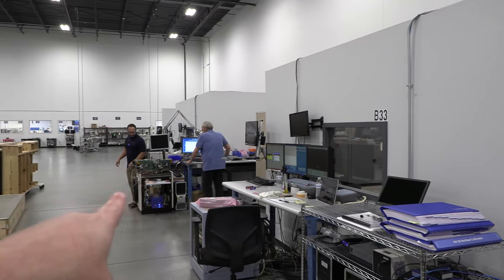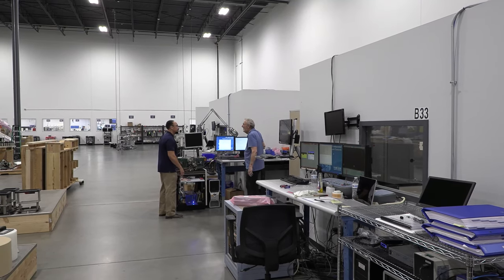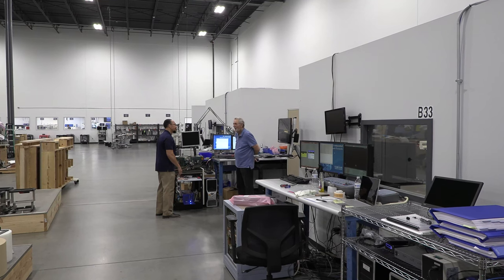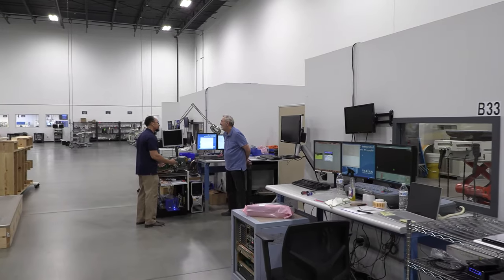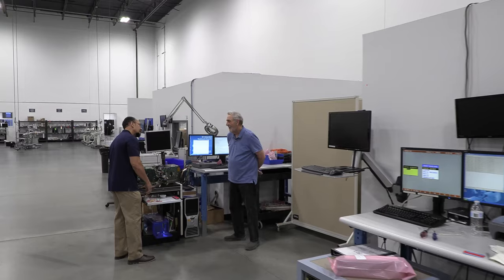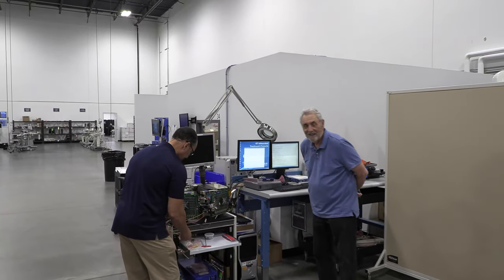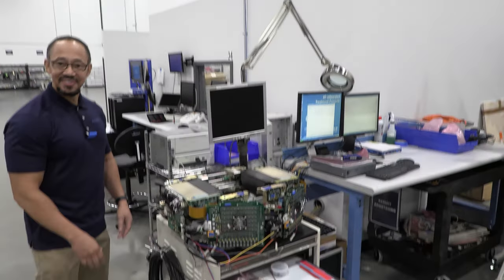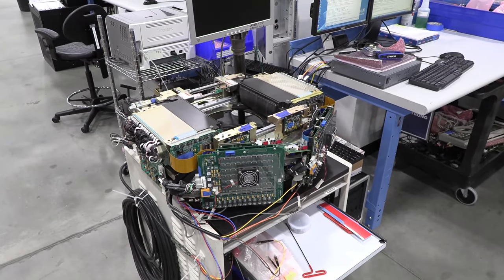That over there looks like a test bench too. That is our MLC test. Instead of doing it on the head, once again, since we have so many parts of the MLC test, we have it external to the machine. Well, that makes sense. I don't know of anybody else that does stuff like that though, because other places I've been to, they test on the machine. Pretty smart people here, putting stuff together external to the machine. I get that. It's all about efficiency, being able to get that out to a customer and off to a site to restore the unit to use.